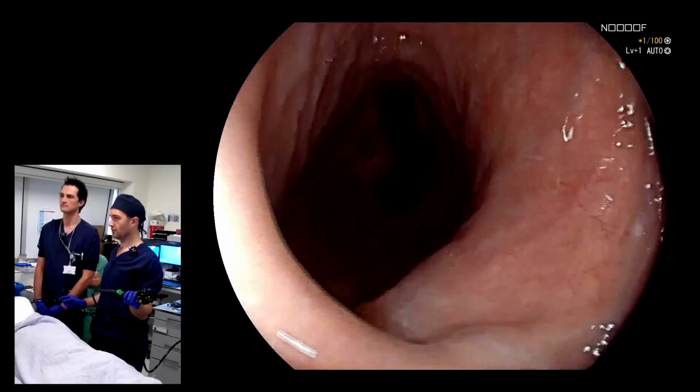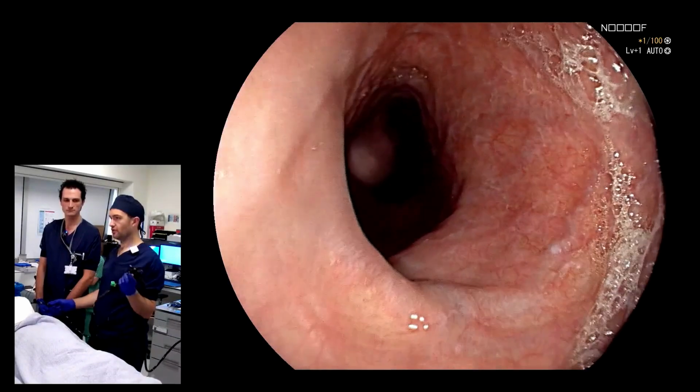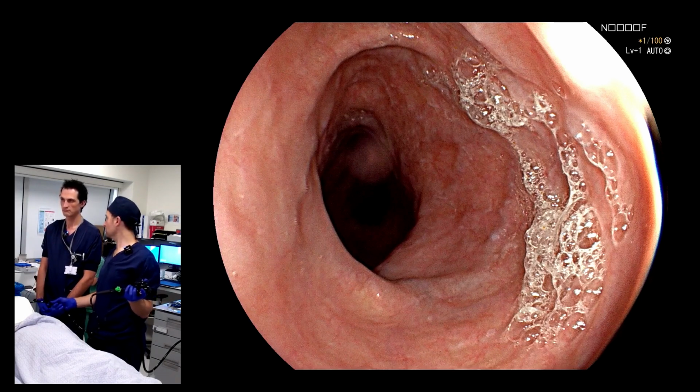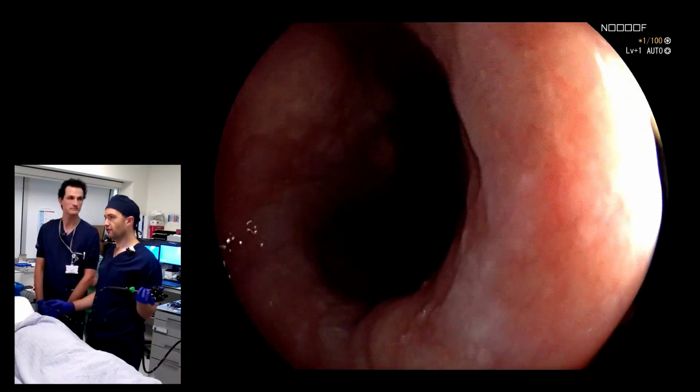So if we break it down, in 2 or 3 minutes, what achalasia looks like with endoscopic imaging. Here we're using a Fujifilm zoom endoscope, 760 type. First thing, saliva present in the proximal esophagus. This is possibly normal, but in combination with the other findings which we're about to show, it is potentially not normal. As we continue down, you have a deformed esophagus.